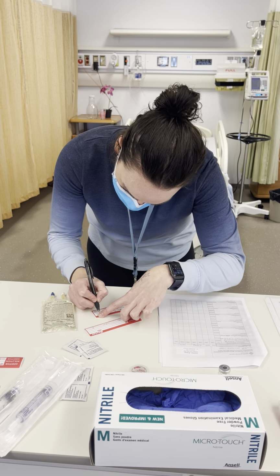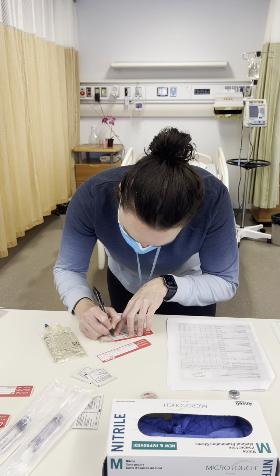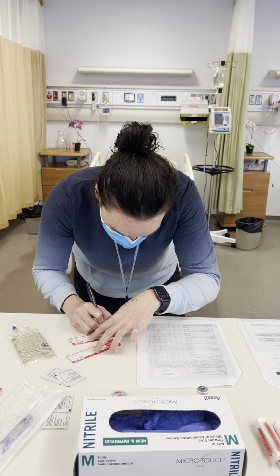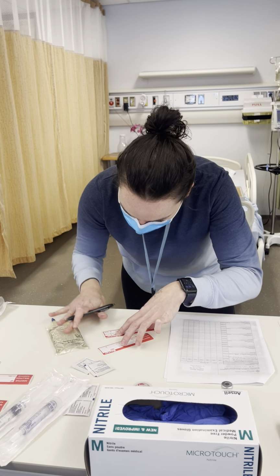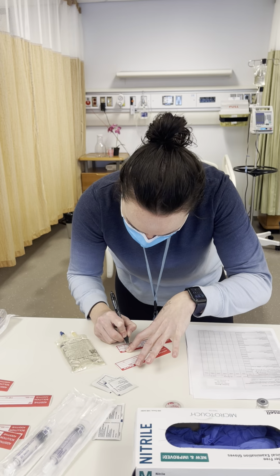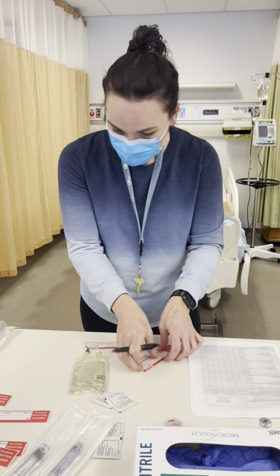So Humulin R, we've got the room number, 100 milliliters equals 100 units. We're going to put our order on here. So we want continuous IV at 2 units per hour. We're going to do our concentration equals 0.99. We know our diluent there, but we'll do a total volume of 101 milliliters. Now we'll put our date, our time, and our initial. We'll have that ready, and we'll do one for our line as well.